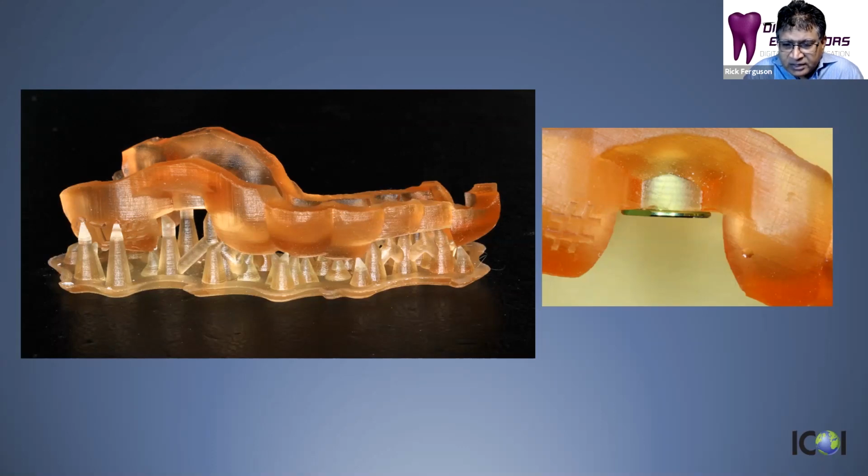Depending on how thick they are, different resins require different thicknesses of support structures. And again, with a system like Formlabs, that's all worked out by the engineers at the company, so you don't have to think about that too much. Although we teach in our courses how to use the proper support so that you get accurate prints. And of course, with a surgical guide, you'd need to put in, depending on the system you're using, a metal sleeve to finish the surgical guide.